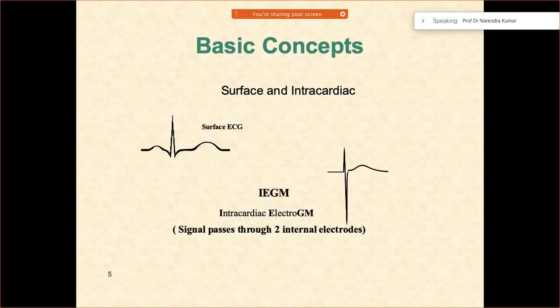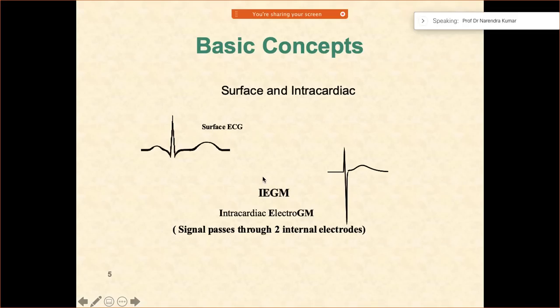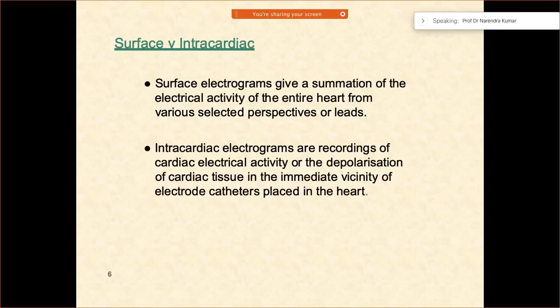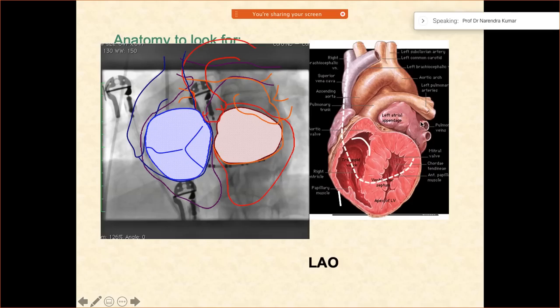When we try to see the electrical conduction system on a surface ECG, this is how it typically looks — you notice the P wave, the QRS, and T wave. However, if you go inside the heart, this is what is called the intracardiac electrogram. The intracardiac electrogram is slightly different from the surface ECG. The surface ECG is measured from the surface of the human body, but intracardiac EGMs are measured from inside the heart in a much better way. On a summarizing basis, surface ECG is more of a summation of the entire heart from the perspective of the leads, whereas the intracardiac ones let you go inside the heart and visualize them directly.